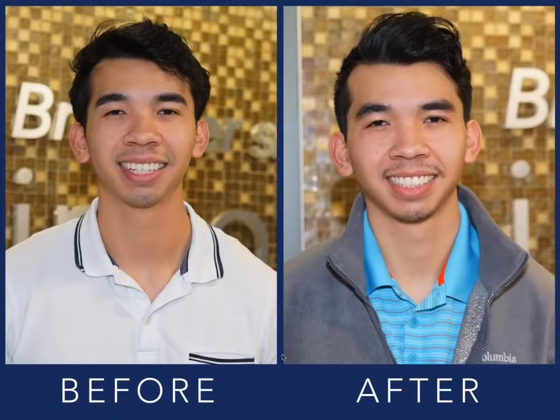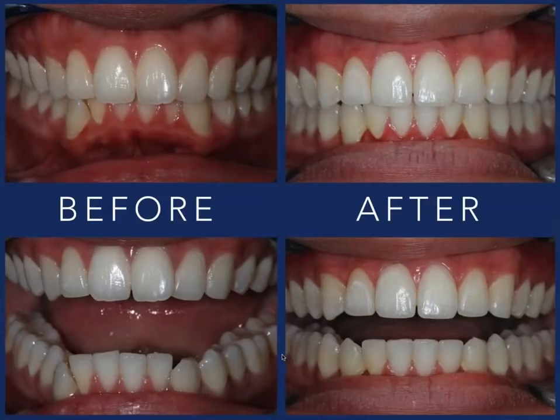All right, here is another patient with some lower crowding for sure, with some pretty significant rotations of those canines out of alignment. We were able to correct that in 6 months for this patient. He needed 7-day tray changes because of those canines being so far out of alignment, and creating more room for that. I knew it would take a little bit longer for that.